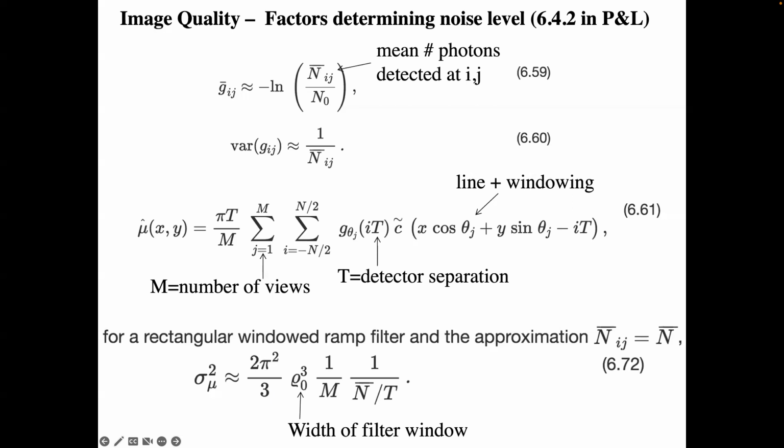But what scanner manufacturers do actually is they test, they take a test region in a scan and say, well, what do you want your variance to be? And you actually type that in to the scanner. You say, I would like my noise factor to be noise factor 4, Mr. Sulu, right? And you put that in there. And then inside the reconstruction, they decide how wide that averaging is going to be, right? So that's another term.